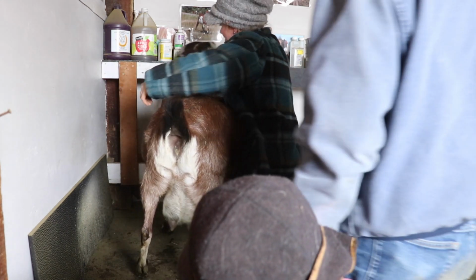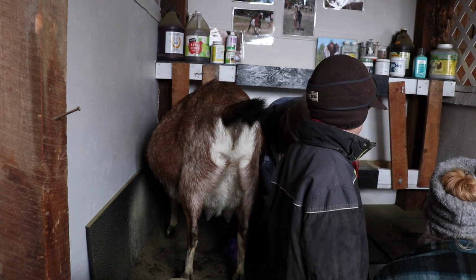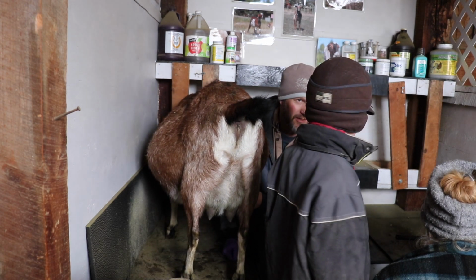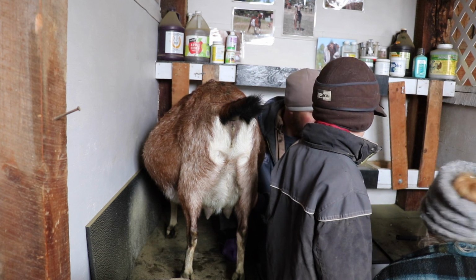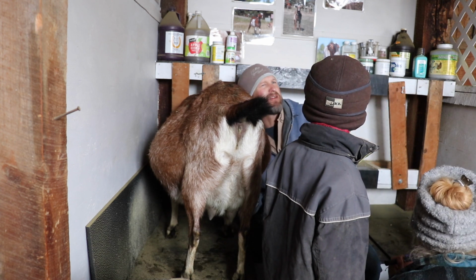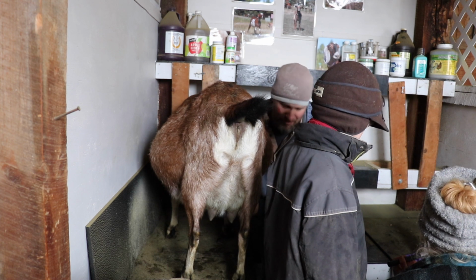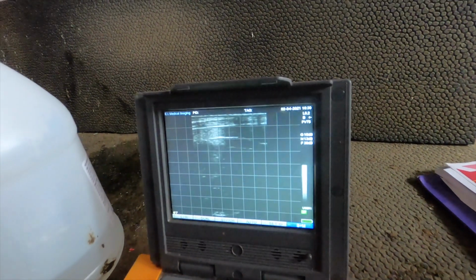Oh, sorry. So the rib cage. Okay, so next time, I think we should really get after it and shave these goats. Shave them? Uh-huh. We'll get it going. There's so much hair right now that I have a hard time getting through the hair to get a really good picture. I mean, you can tell, but it's not like on a goat. You should be able to count ribs and see the rumen in that kid.